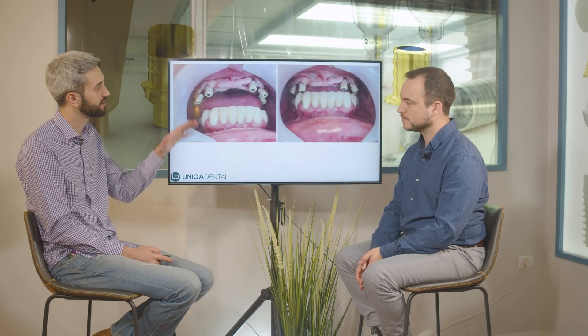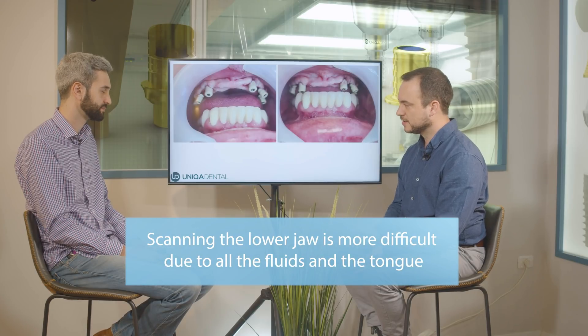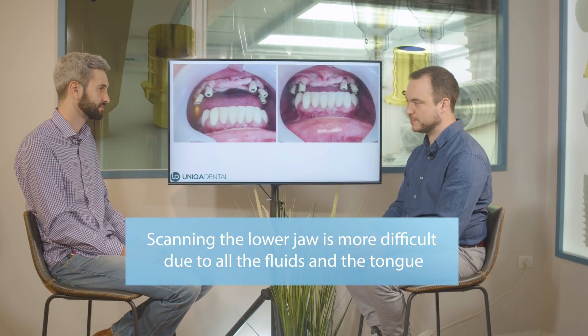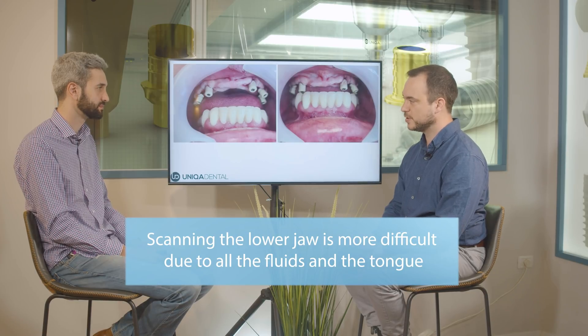Because it's not moving? — Exactly, nothing is moving. So if you had the same case but reversed, it would be much tougher on the lower jaw? — By a lot. Because of the tongue and all the fluids? — The tongue, the small amount of gingiva, the cheeks — everything that's moving all around those implants.